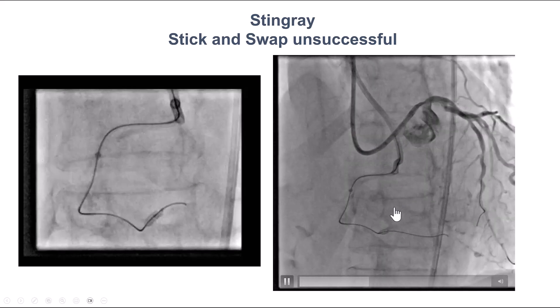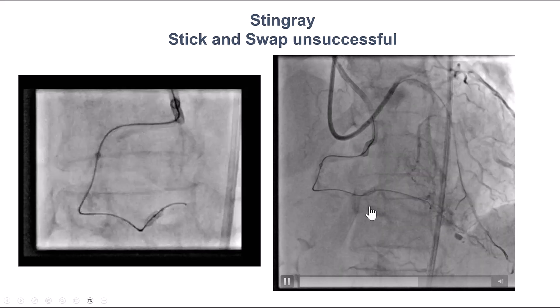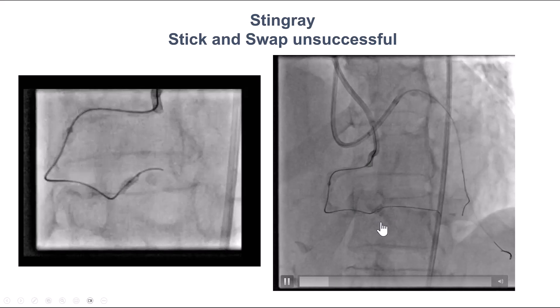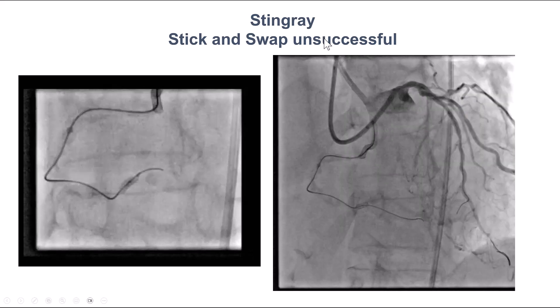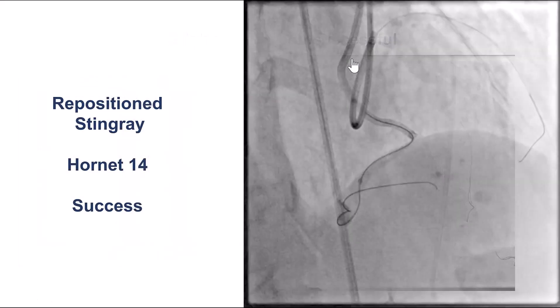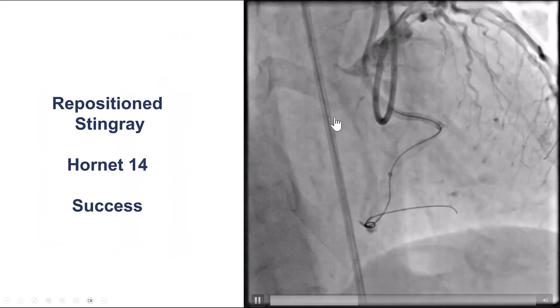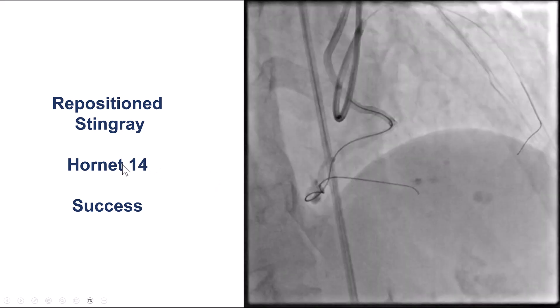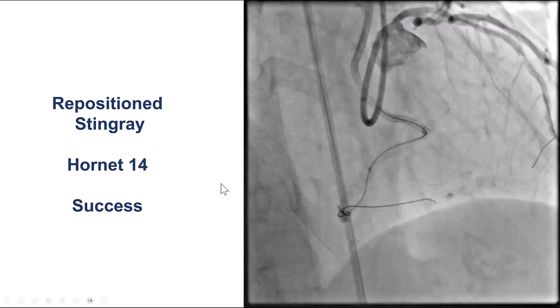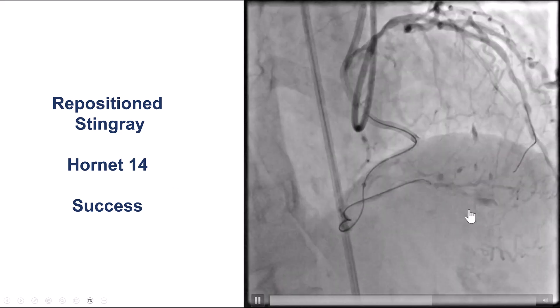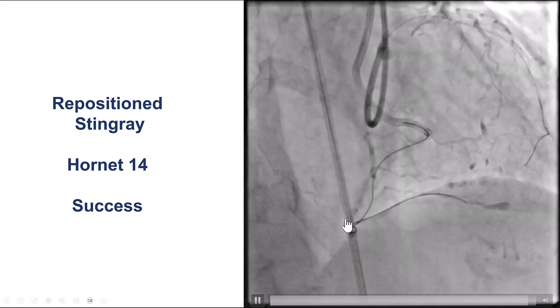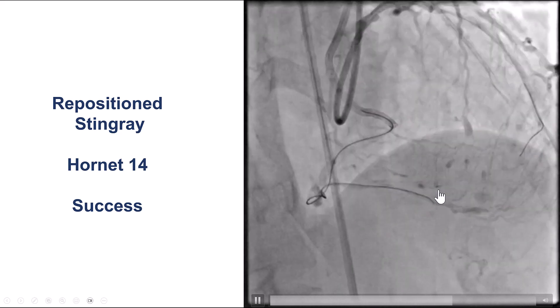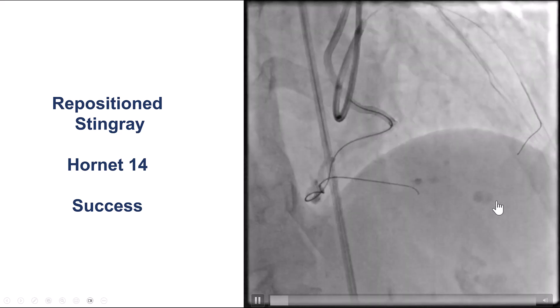We then went to the distal right coronary artery, which seemed to be less calcified, and tried to reenter. We did the stingray balloon with stick and swap, but it did not work. We repositioned the stingray balloon and used a stiffer wire, the Hornet 14. Using the caudal projection with better visualization, we successfully were able to cross into the posterior descending artery.